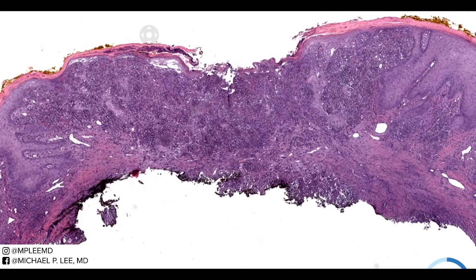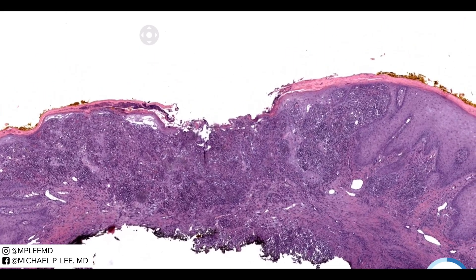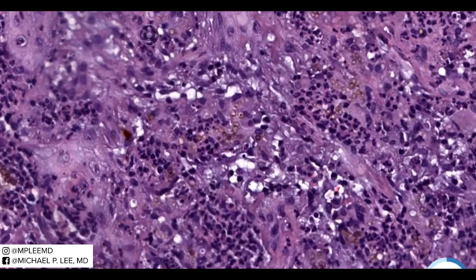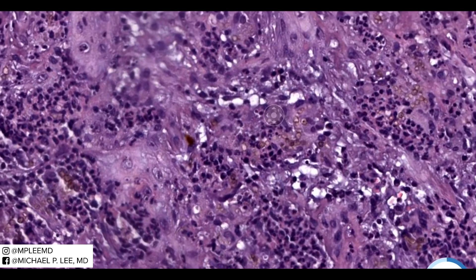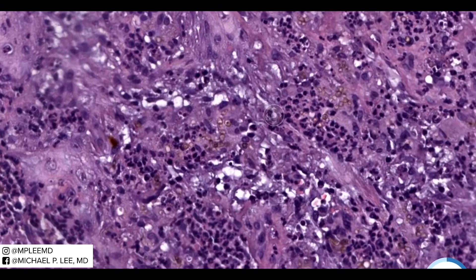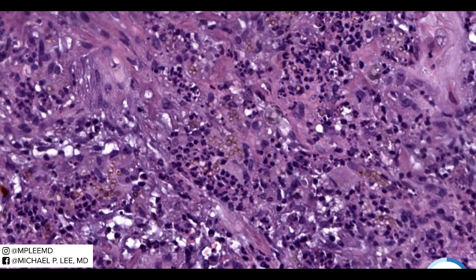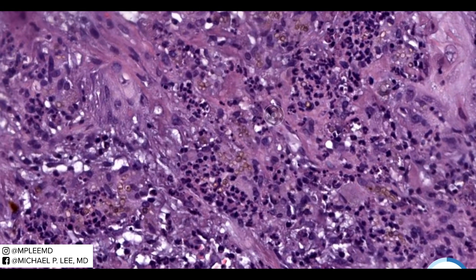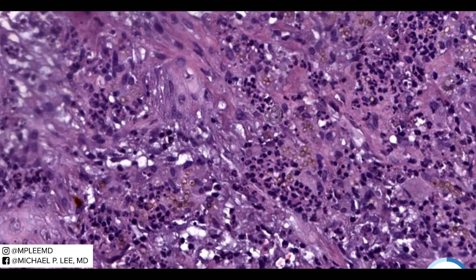And finally, here's another example. This one's an ulcerated lesion. You can see a bunch of these pigmented yeast form structures very closely attached to each other. It's hard to make out any hyphal forms in this example.